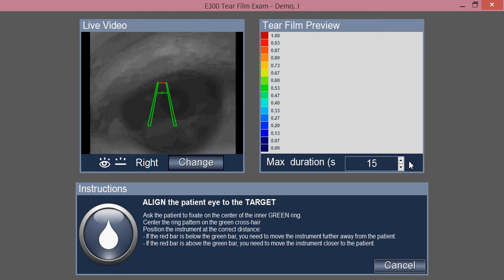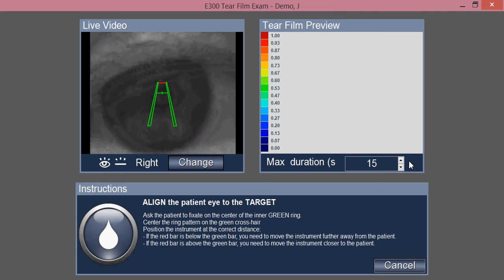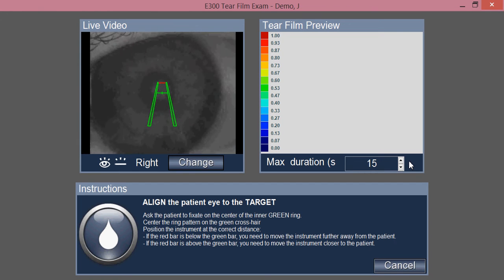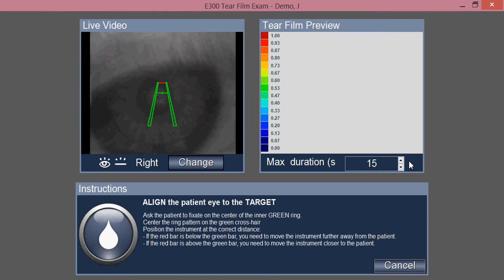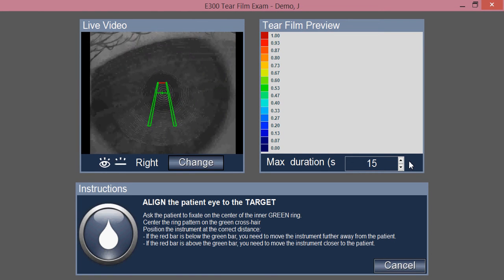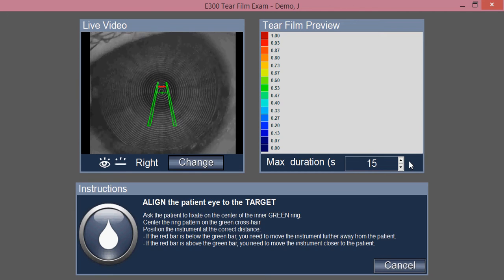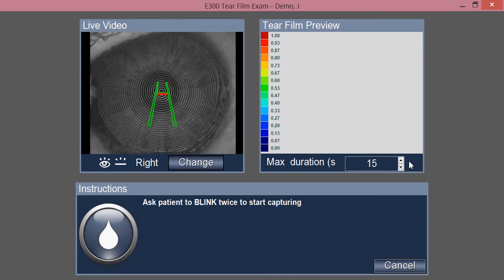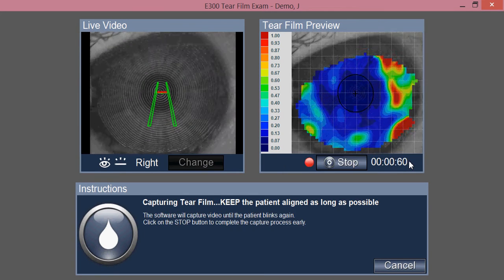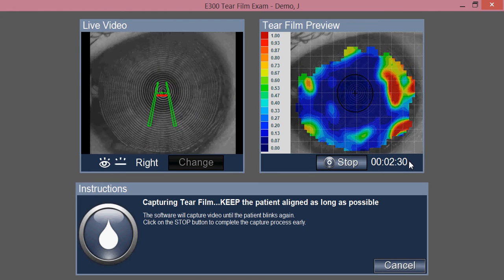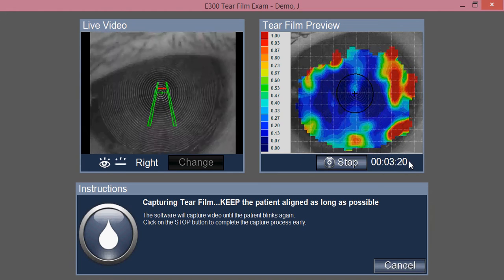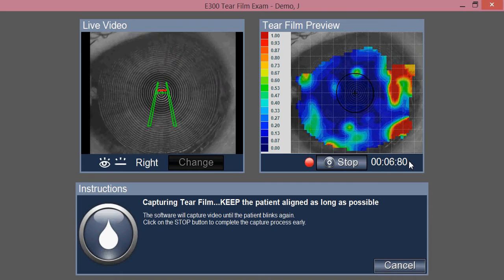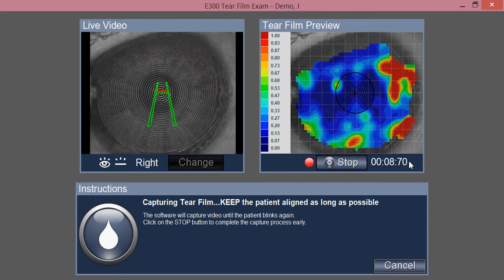You center the patient behind the unit and position the Medmont in order to take a capture. Ask your patient to take two blinks and hold their eye open as long as they can. Take two blinks and keep the unit centered for that 15 seconds or until the patient needs to blink again.